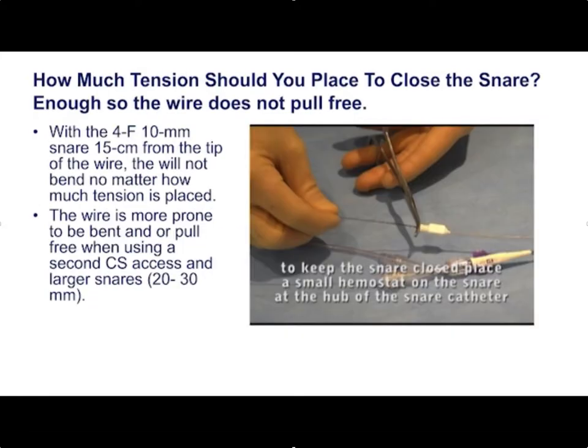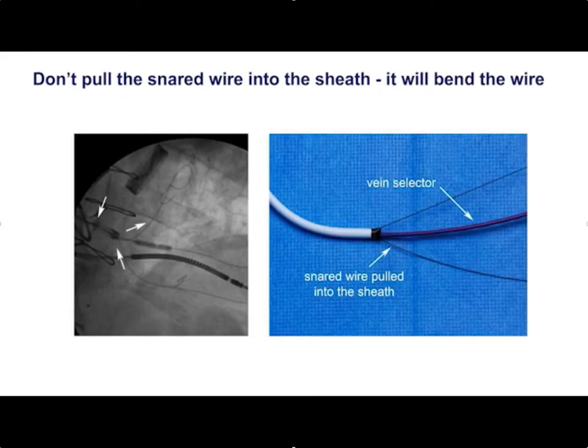15 centimeters is just about right. You want to make sure it's nice and tight. To do that, take the hemostat and push against the hub of the sheath while pulling tight on the snare loop — you can actually see the snare catheter accordion a bit, which tells you that you've got plenty of tension on the snare.